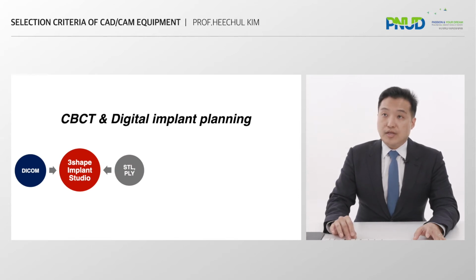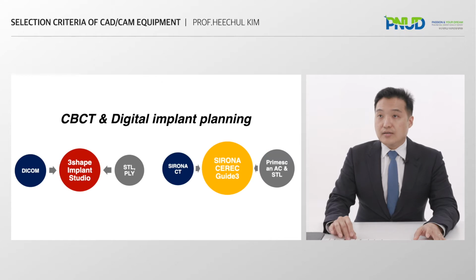Implant Studio enables designing on any type of CBCT and intraoral scans. On the contrary, CEREC Guide 3 can only design using the data generated by Sirona's products, which guarantees the most optimized resolution and merging result. Unless you own both of the equipment, you can't use this.